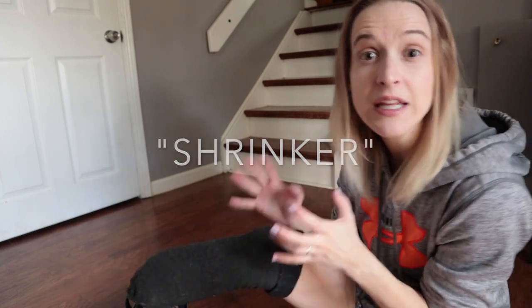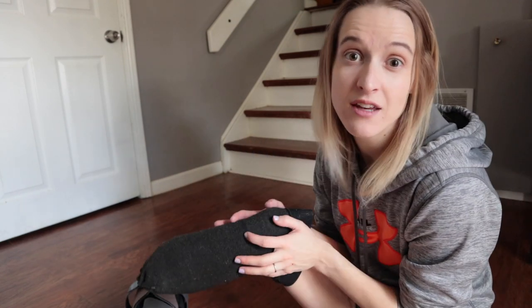My hoodie just stuck to it. Anyways, I want to walk you through putting it on and show you what it looks like. So first of all, they gave me this. This is a shrinker. It's like a really, really tight sort of thick sock.